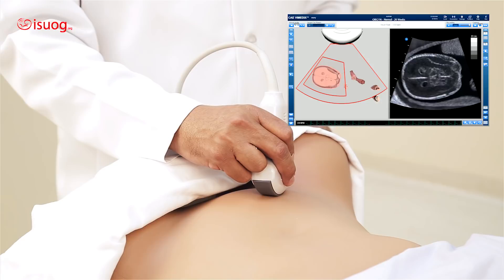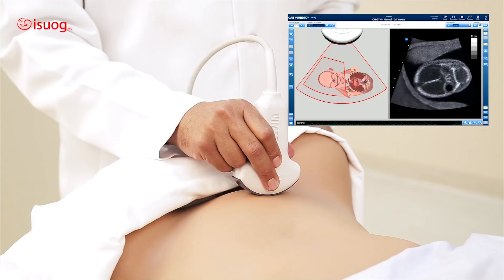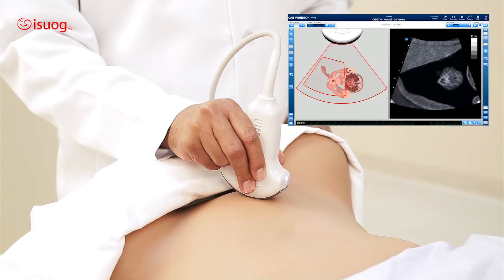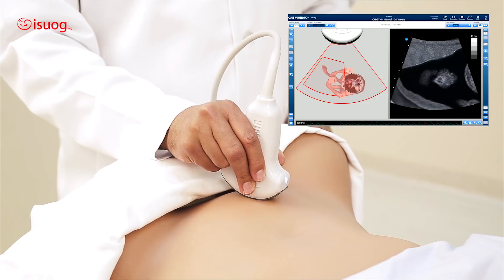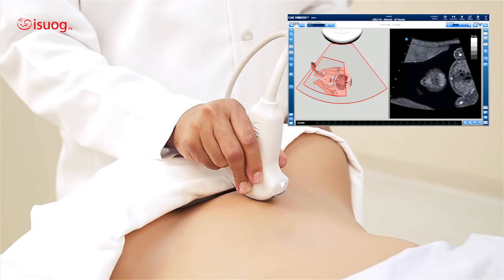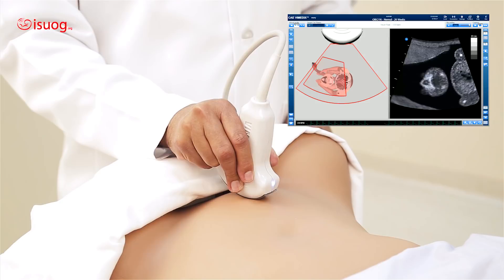Then I slide on the broad to move in front of the face — and there you can see the face. If you want to correct the lips and nose, you can rotate even more, and you can see the nostrils. If I want to get it in the center of the screen, I slide on the narrow. And if I want to get a good view of the lips, I angle and slide on the broad. And there, you have the whole lips.